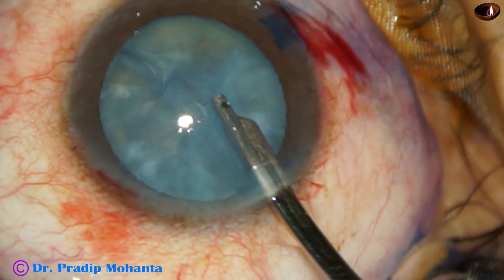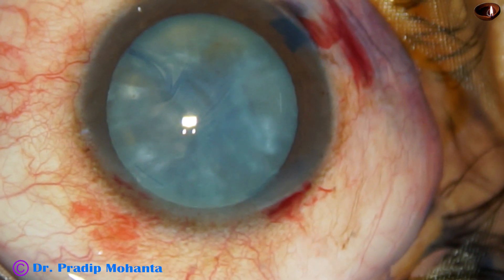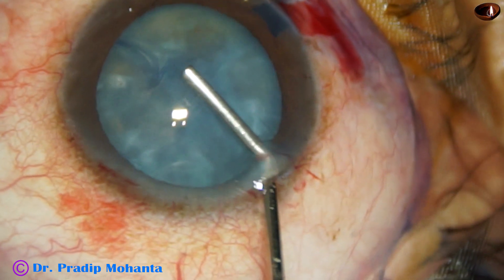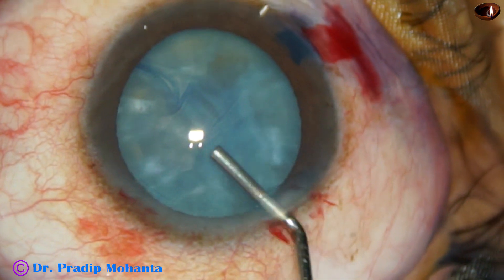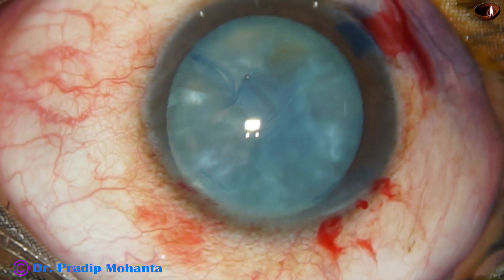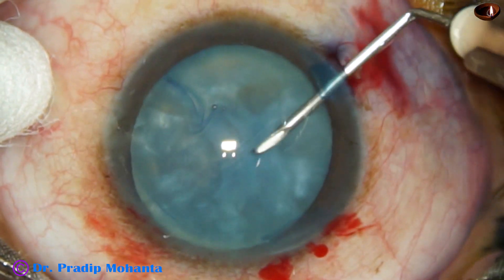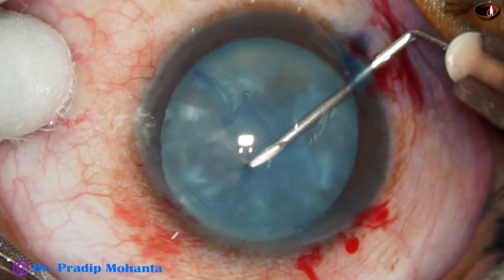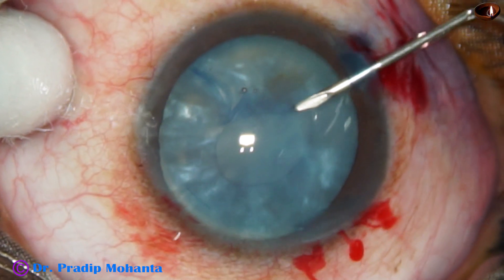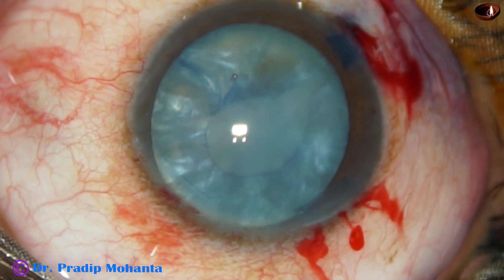Now the biggest challenge in this case is the capsulorhexis. The anterior chamber is filled up with a viscoelastic substance — this is 2% hydroxypropyl methyl cellulose — and now I am taking a 26-gauge bent needle. As I incise the anterior capsule, some fluid comes out. So this is an intumescent cataract with anterior capsular fibrosis.